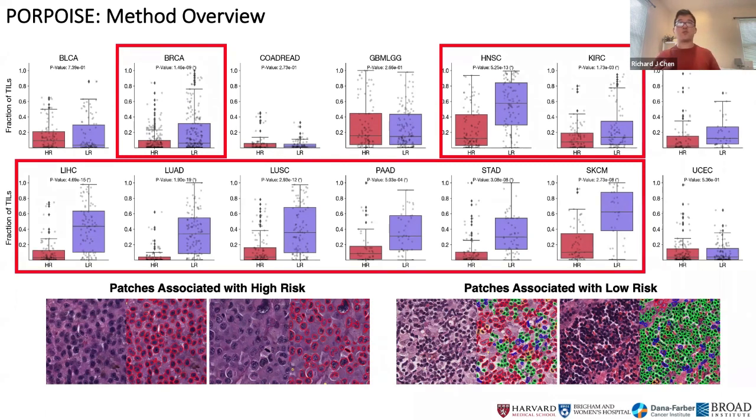Where this finding contrasts with other findings in pathology is that many studies segment these cell populations, quantify the co-localization and correlate it with survival, and see higher correlation with longer survival times. This work is slightly different: we aren't giving the model a priori where the tumor and immune cells are.